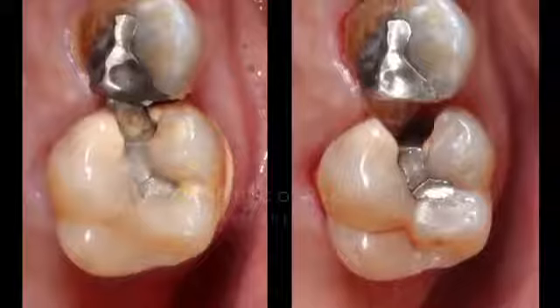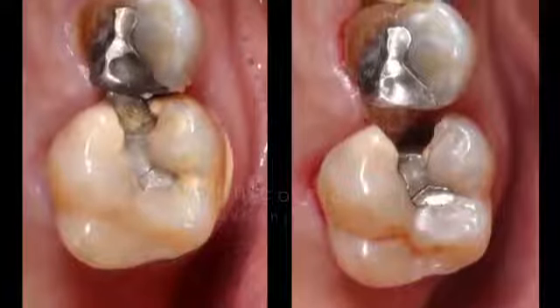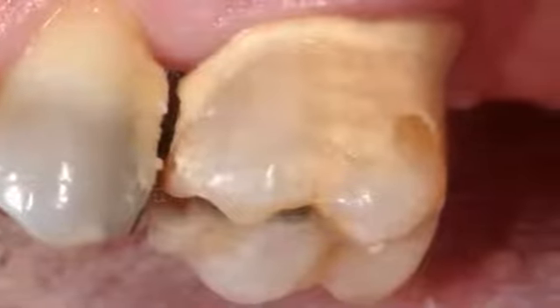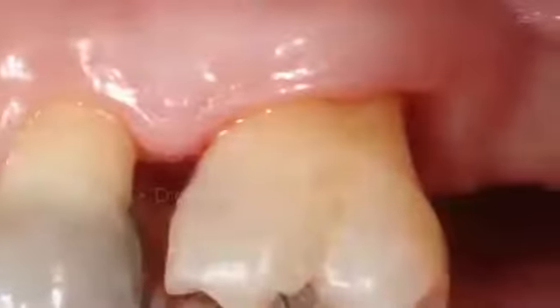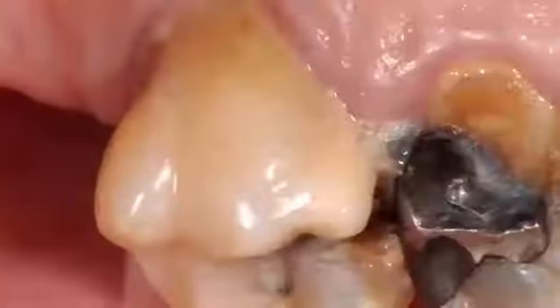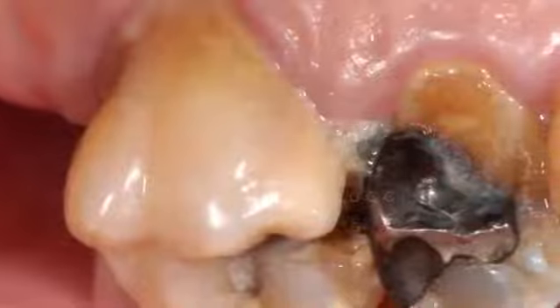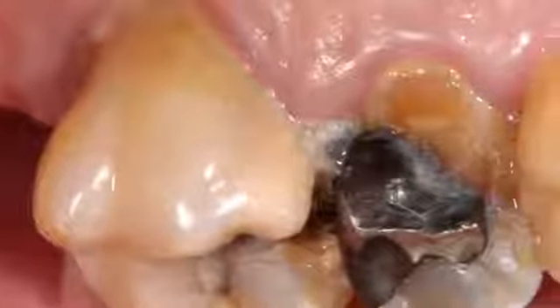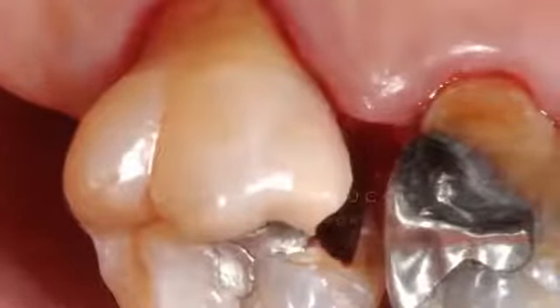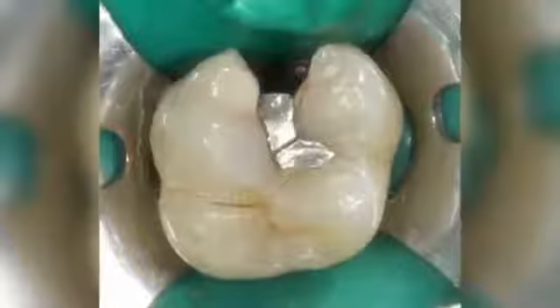The palatal cusp of the second premolar was fractured, but each pulp responded normally to tests. Scaling with ultrasound was performed and the patient instructed in proper oral hygiene. Root canal treatment of the first molar was scheduled.